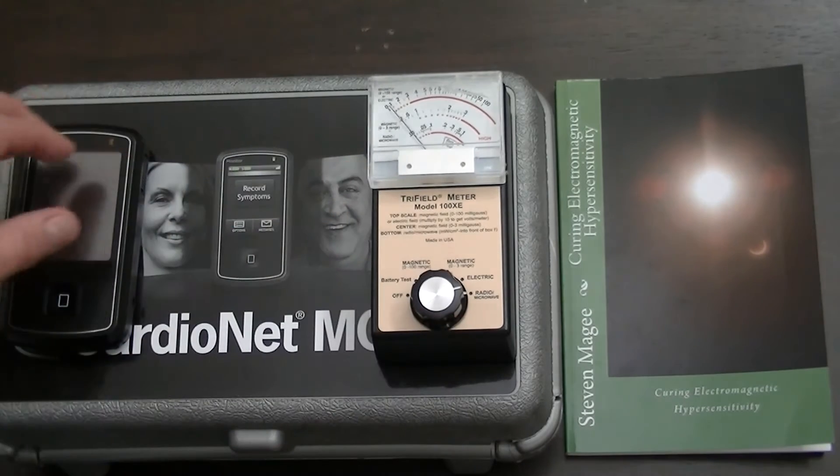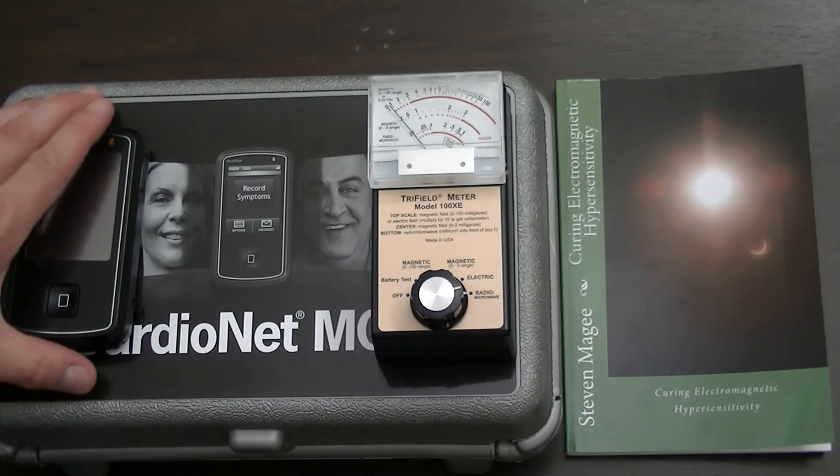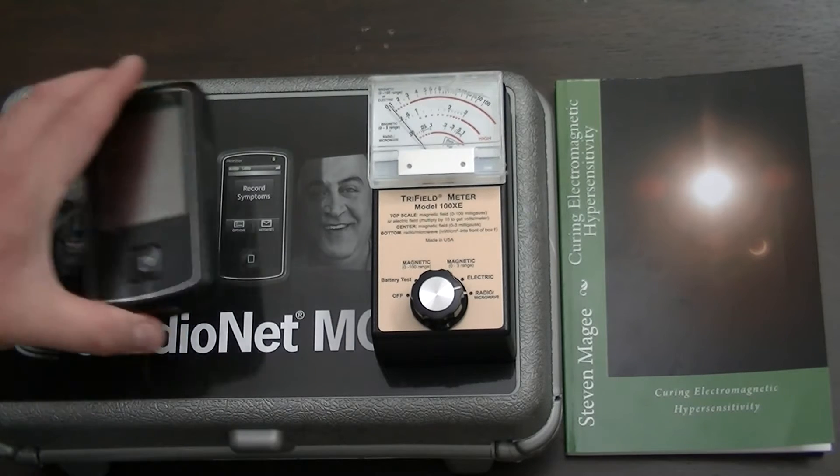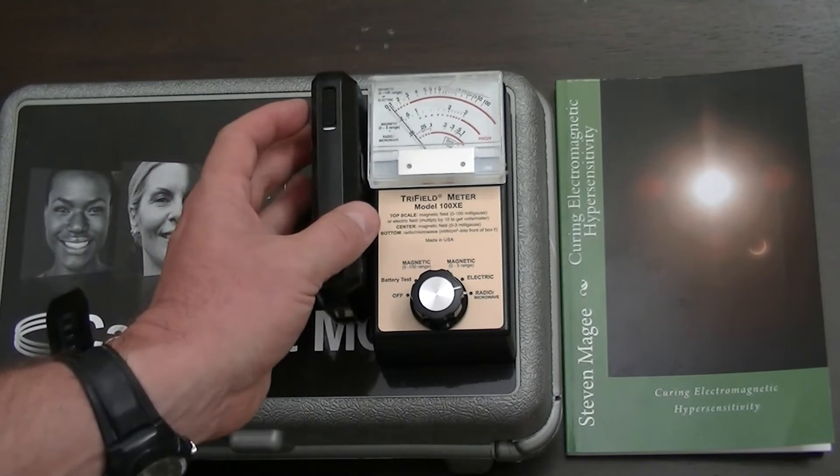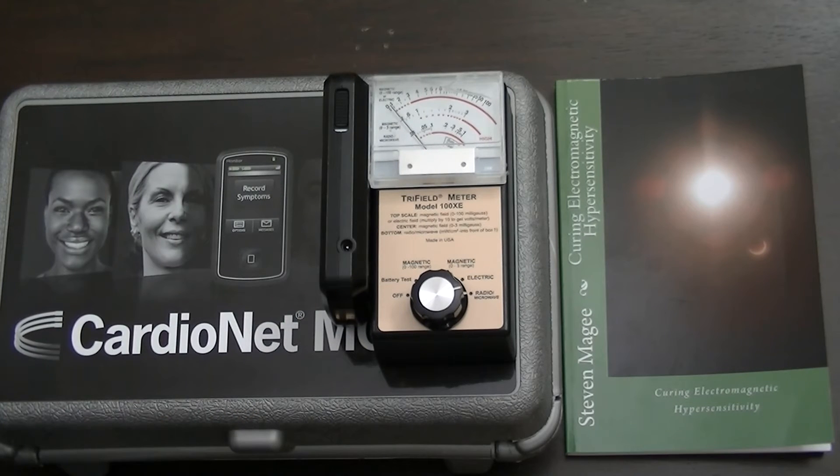Let's try the last setting, which is the radio microwave setting, and see if we can pick up any emissions. There's a slight pulse on the radio and microwave setting.